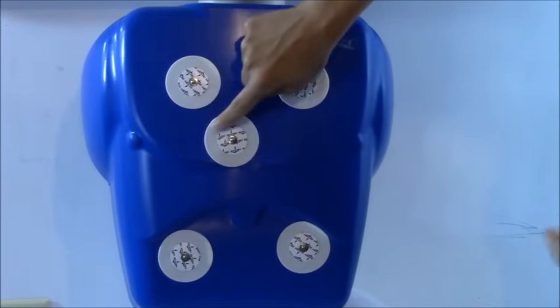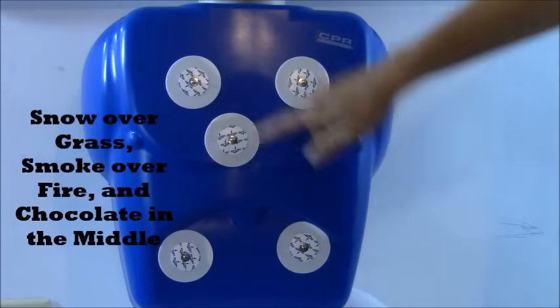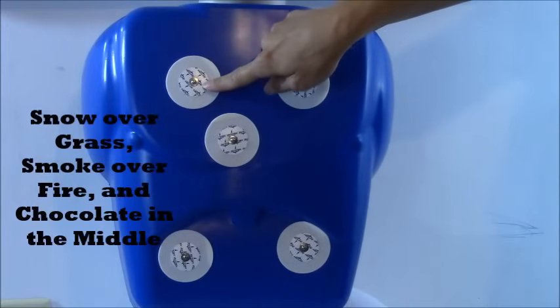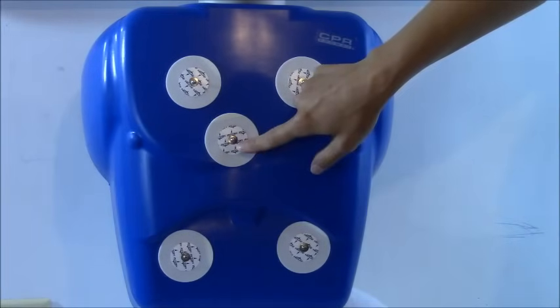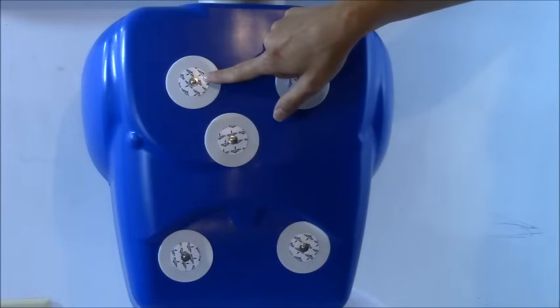And you are done. And then you'll connect your wires. So let's go over it again. You have snow over grass, smoke over fire, and then chocolate in the middle. So you'll connect your electrodes to this.